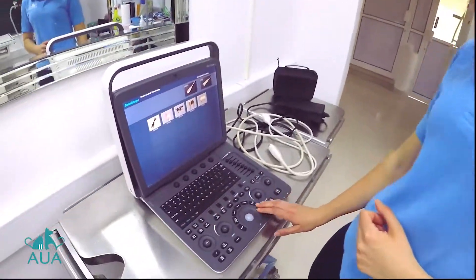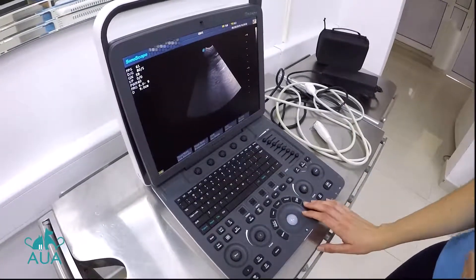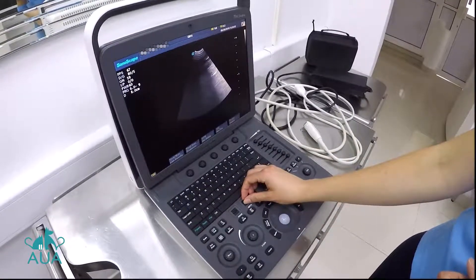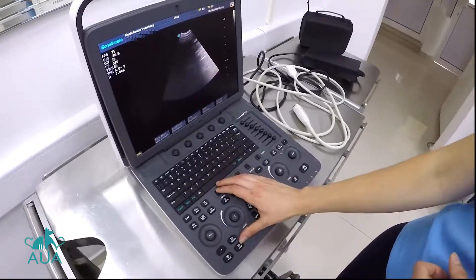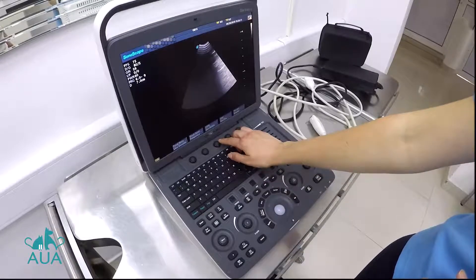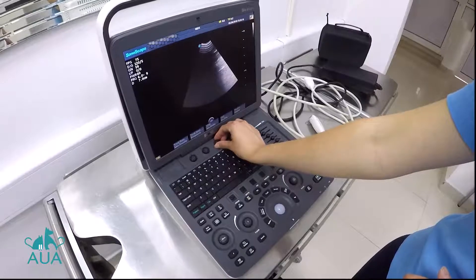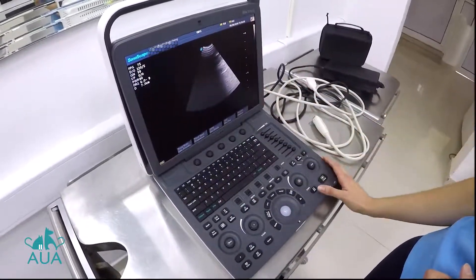I'm going to create a preset for a small dog abdominal scan. Going in as normal, I'll reduce my depth first of all because the body's going to be small. I'll move the focal point to where I think you'll want it. For dynamic range, since I'm thinking about scanning a liver, I'll use a wider dynamic range so you have a greater range of grays in your image.